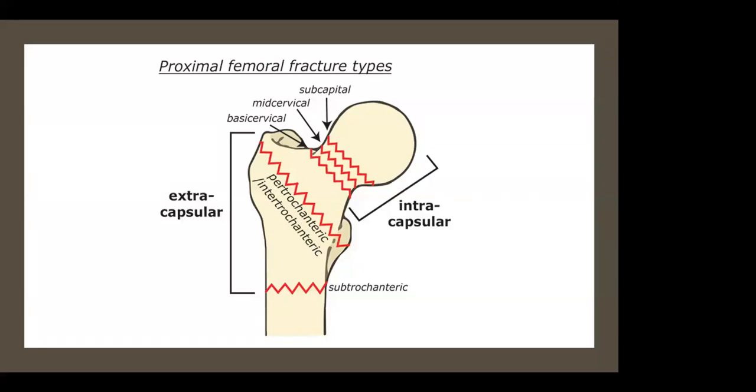Again, reviewing imaging is all about being as concise and specific as you can. So when you're the junior doctor on call, calling your surgical registrar or consultant, you're able to describe what you see. I just want to reiterate that your main aim is that they should be able to know exactly what kind of fracture you're looking at without having to view the image directly.